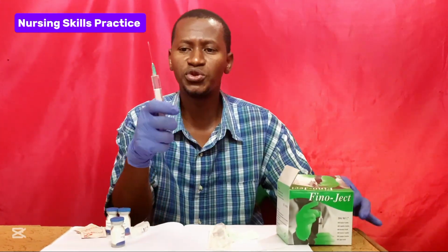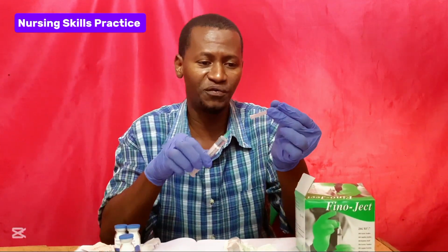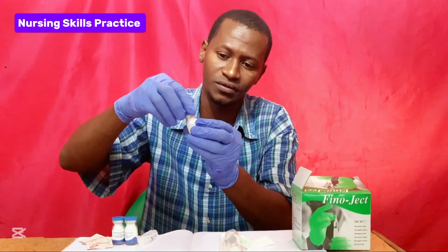So you have to withdraw 2.4 ml of sterile water for injection. Then you put the cap on the needle to maintain the sterility of the drug. Then you get the vial containing the white powder of 250 milligram of Ampicillin injection.